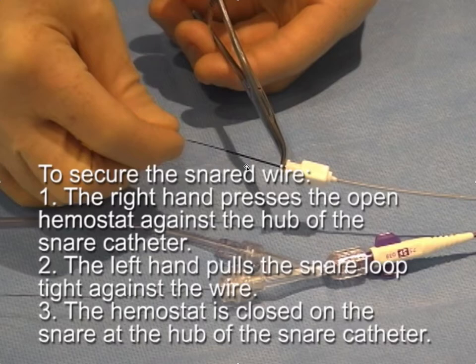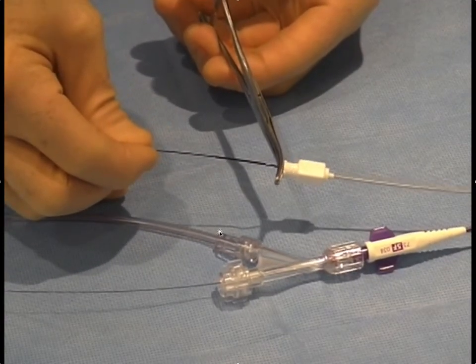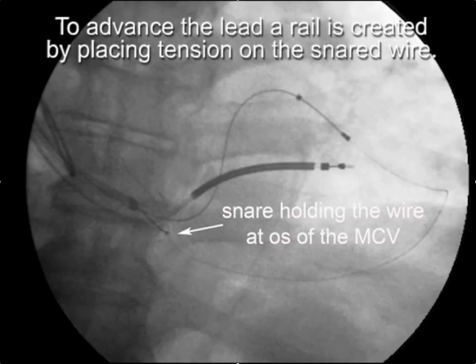This is how you snare the wire and how you make sure it's nice and secure: push against the hub and pull on the snare tip.